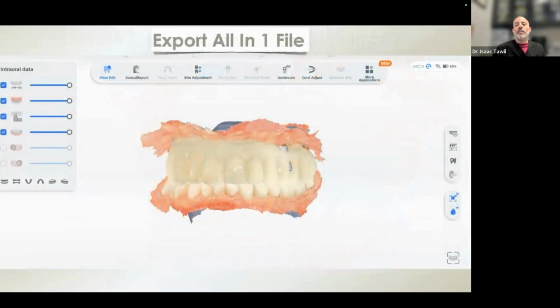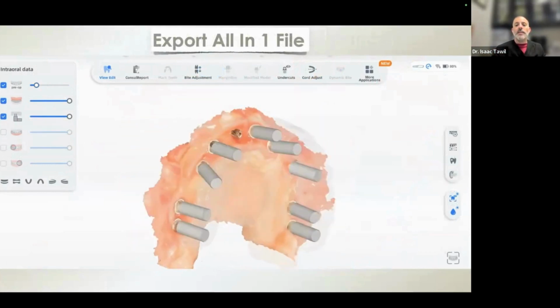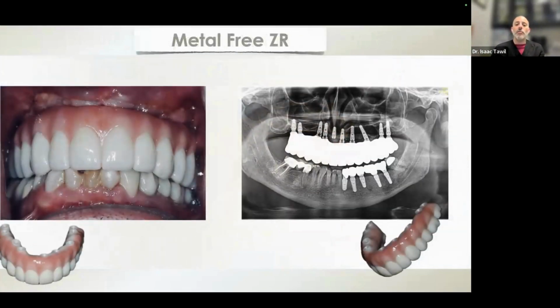I've converted everything over into the scan bodies that I like to use. And I have my bite. I have everything stacked, so it goes over to the lab for our next design, and they will then send me back a design to approve.